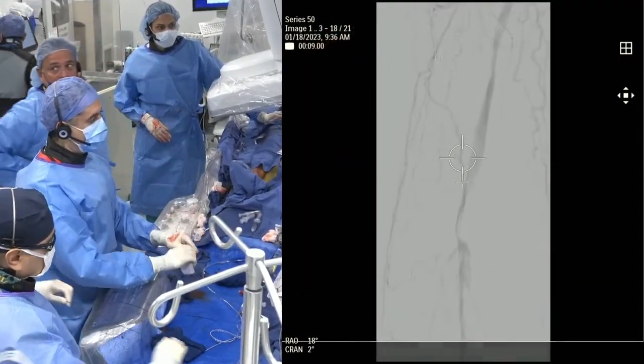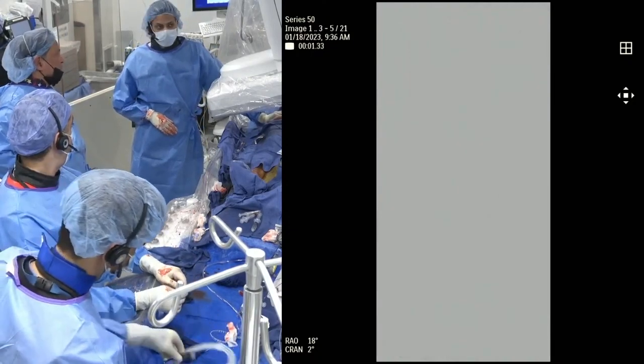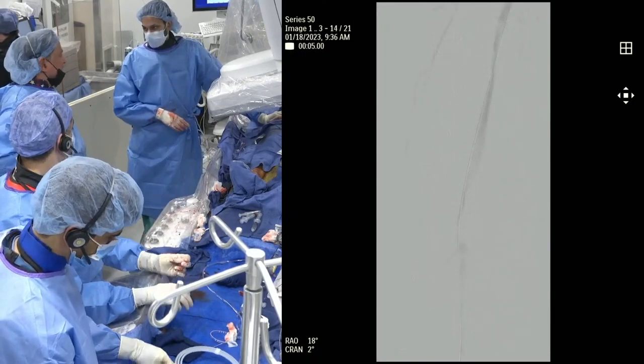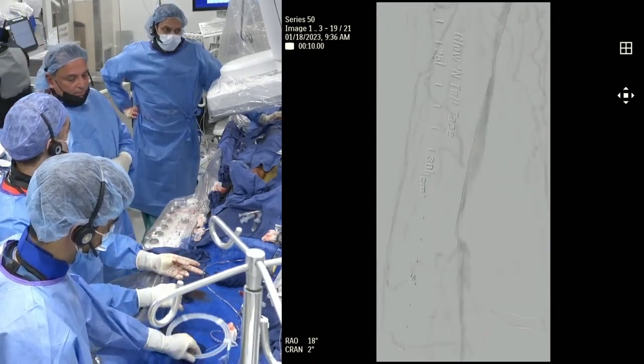You want to stent this first, Srini? What are your thoughts, Ajit? No, I would stent the whole thing. Would you stent it first before your shockwave or after? Oh, no, I would shockwave the distal part, whatever we didn't do before, and then a Dorado. Yeah, for sure. I would shockwave first and stent at the end.